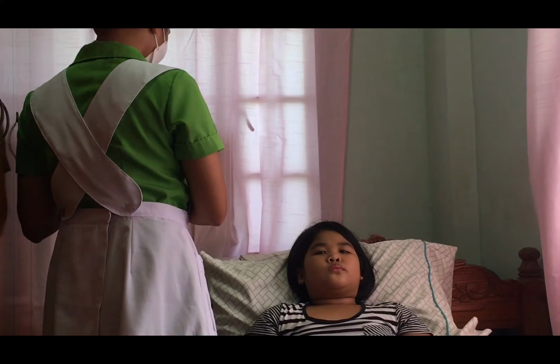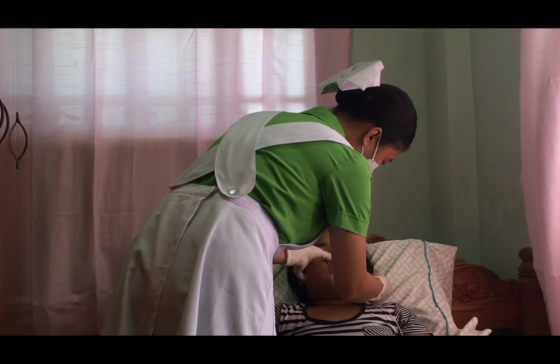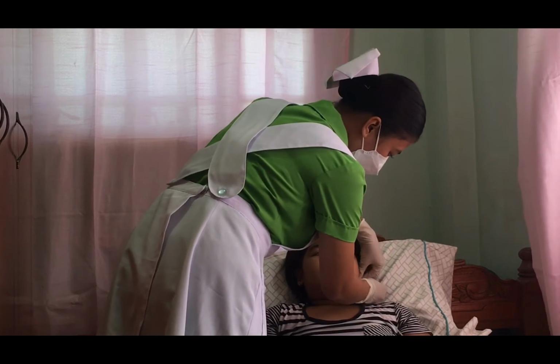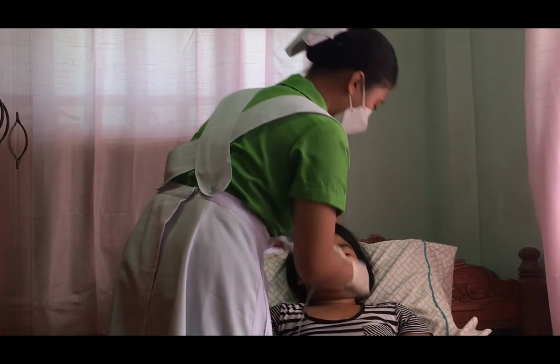Measure the tubing by putting the tip of the nasogastric tube on the tip of your nose, then extend it to your earlobes, then extend it down to the xiphoid process. Mark the measured length with a marker or note the distance.